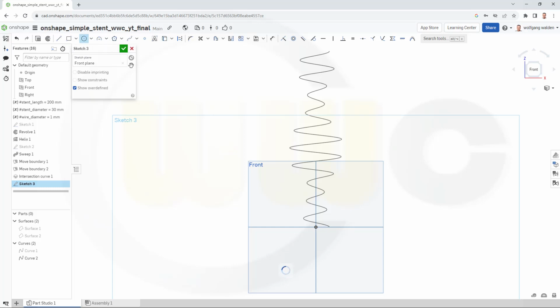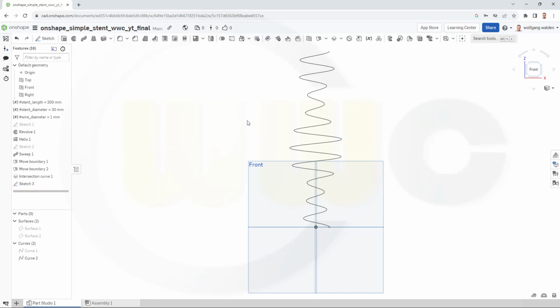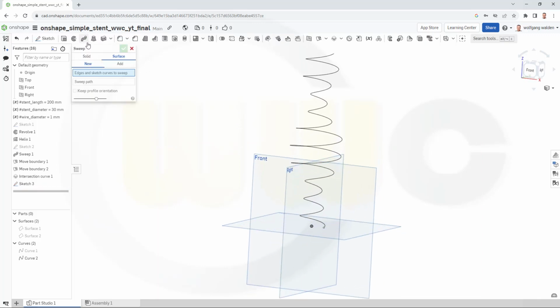And then go for a circle which sits right here, and that diameter should be 1 millimeter. So give it a dimension, and this should be the wire diameter. Okay, finish that sketch, and now let's make a sweep. So I want to have a solid in this case, and I want to sweep sketch 3, and the sweep path would be that intersection curve.